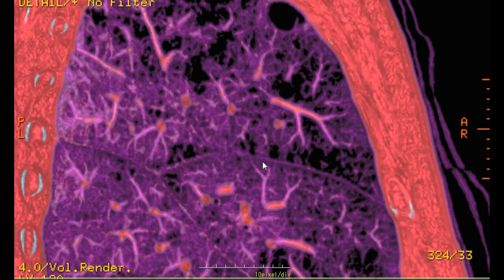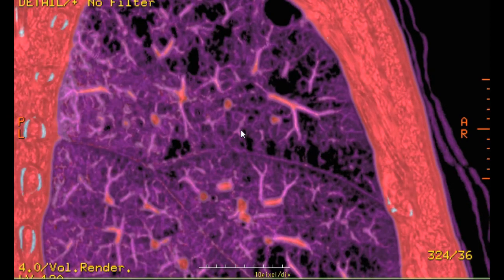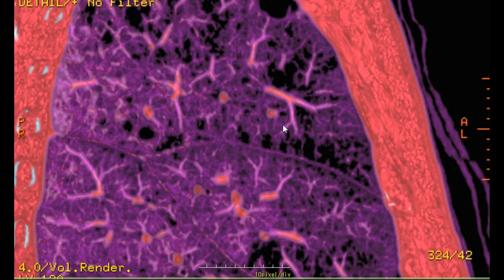And this area here is ruptured alveolar, and these areas here and there are also ruptured alveolar. This shows the different distribution of emphysematous pattern between each lobe.